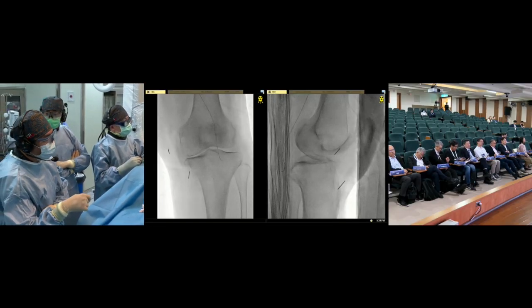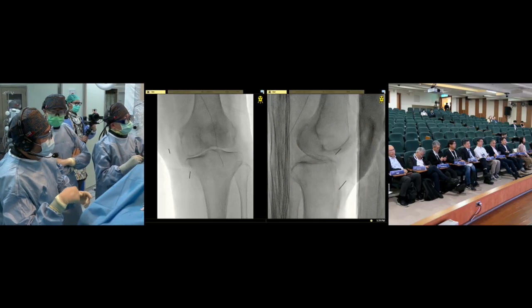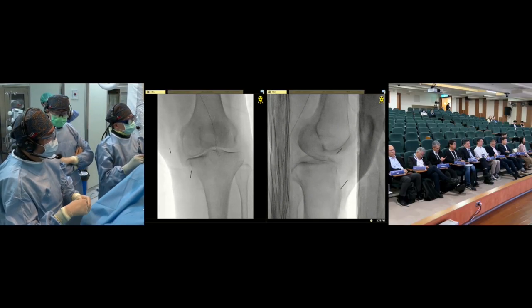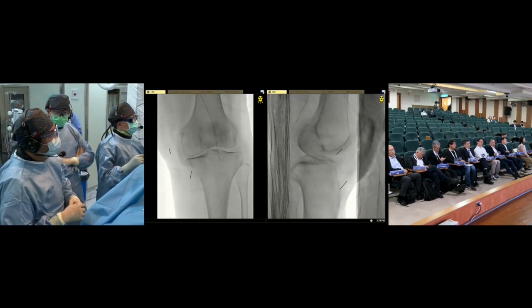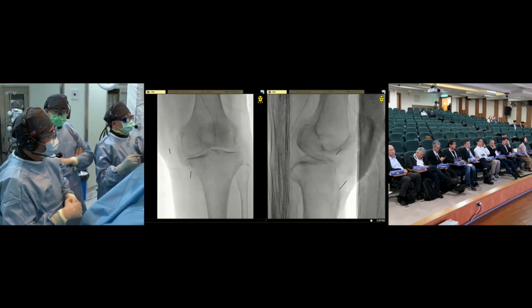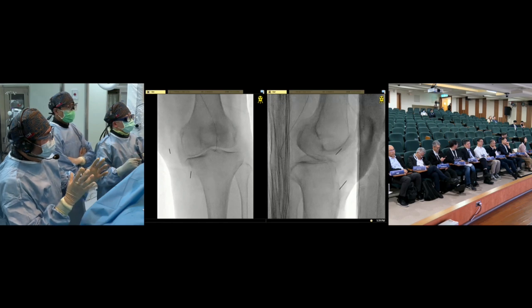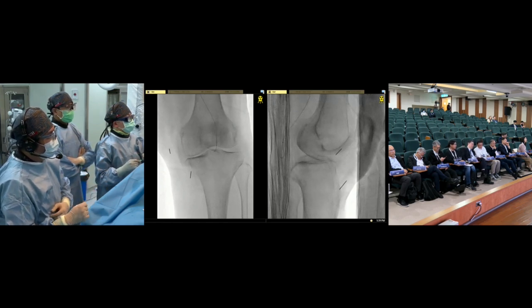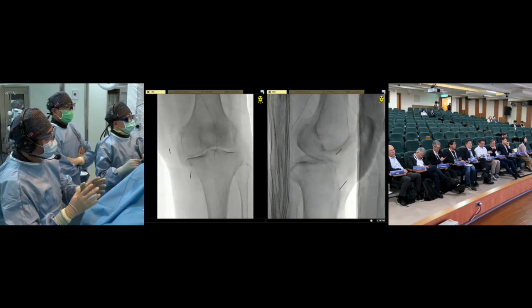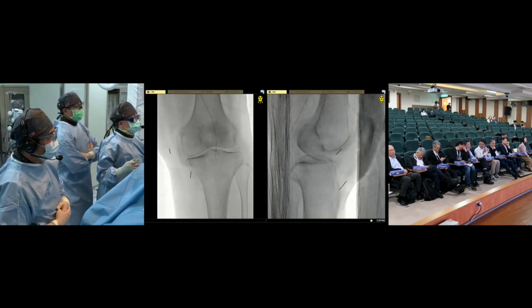We can shape the microcatheter. For me, I shape both the microcatheter and the micro wire into a J curve. The guiding catheter I use is also a J curve, and it makes it easier to engage the vessel, because the popliteal artery is very large but the genicular artery is very small. So you make a curve, and it makes it easier to engage the orifice.